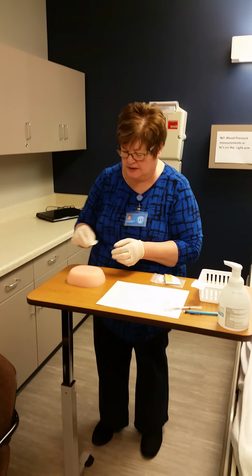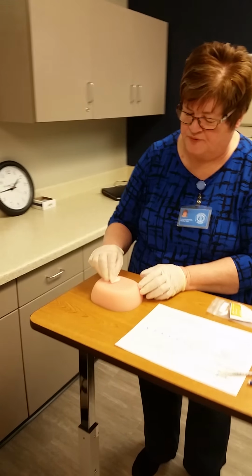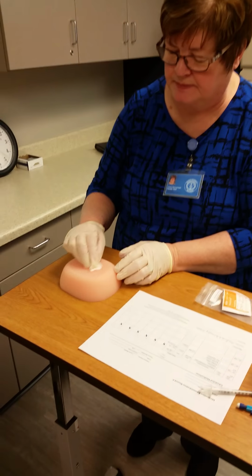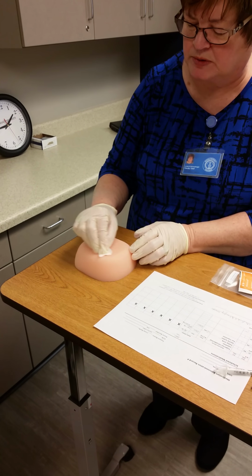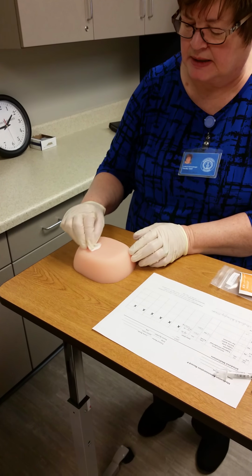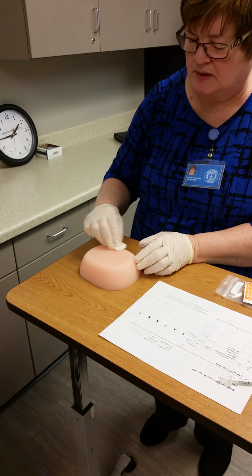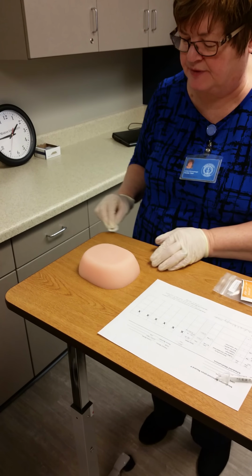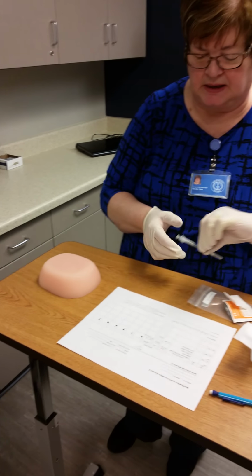And we're going to start and cleanse in the center of the area for 7 or 8 seconds. So you're doing a 1 inch area, and then you're going to go out to the 2nd inch, and again doing 7 to 8 movements or seconds around, and come off so that you don't cross over. We're then going to take the needle.